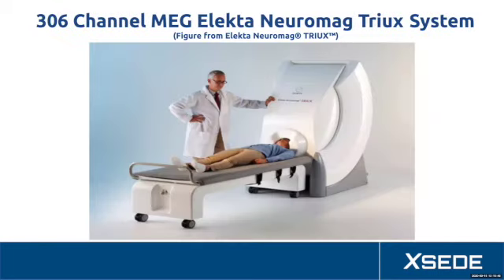So here's what the MEG, magnetoencephalography instrument, looks like. And one of the reasons that we probably have the only long 4 to 6 hour recordings of sleep with subjects is because you can imagine trying to sleep in that without turning your head. If you're a back sleeper, you'll probably be okay. But this instrument is about a $2 million instrument.